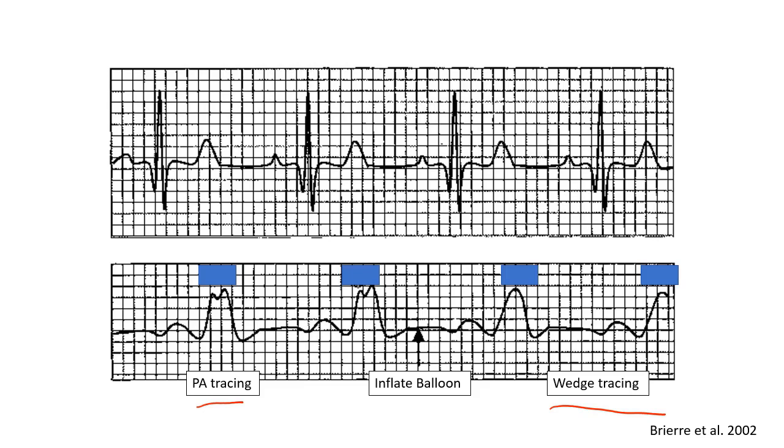There's two ways to tell the difference. Or I guess in this patient, one major way, but essentially you're going to see a systolic waveform here, a notch, and then you're going to see that big V wave, right? So you see both waves here, but when you wedge, you just see that one big V wave. This is important because nowadays with echo, we can go into our PA knowing that the patient has florid mitral regurg, because we've already probably put the probe on and seen that. Then we know that when we get to the wedge, we're going to see these huge V waves.